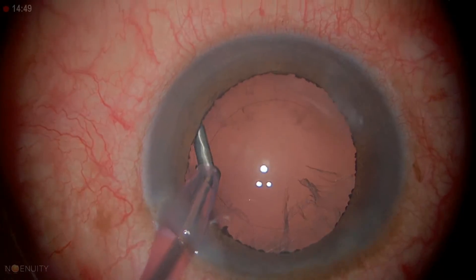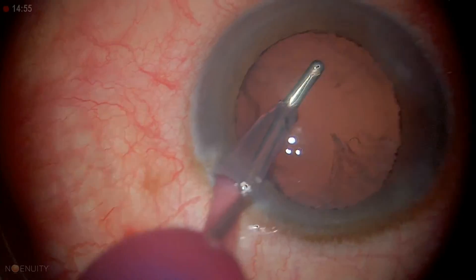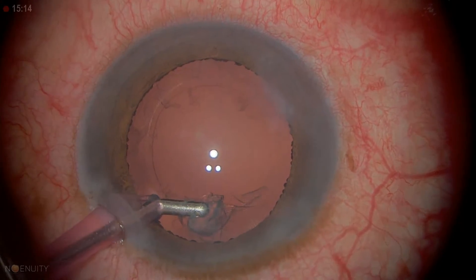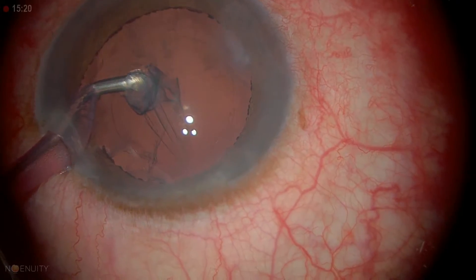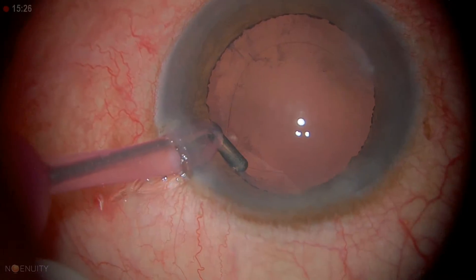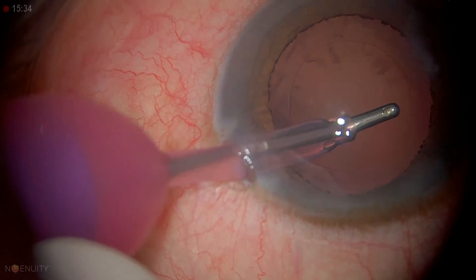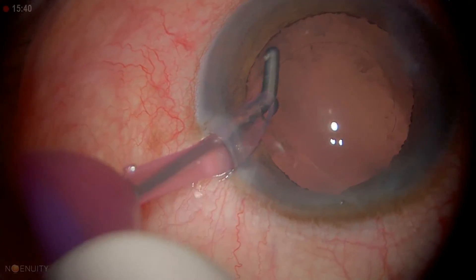We'll put the chopper back and remove the cortex — there's not a lot of cortex here. You can see this tangential stripping. Sometimes you have to go a little further. He has some sticky cortex; it's not coming off as easily as we'd like. The lens is bigger, so the bag can be a little more floppy. The sub-incisional is always the toughest.